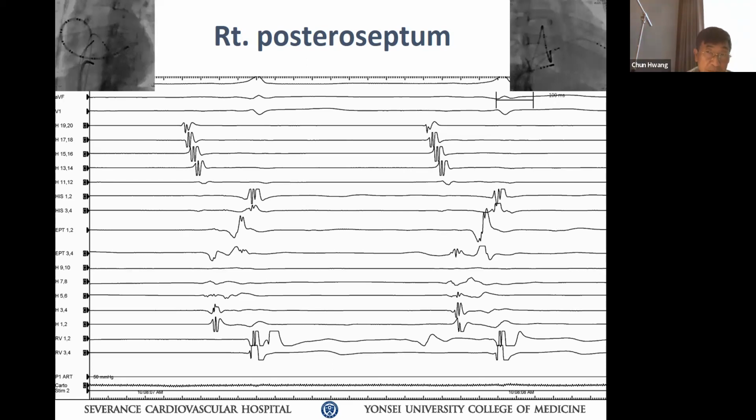It's very important. 그래서 꼭 캐테터 하나만 가지고 생각하지 말고 항상 you think about what other thing I can do in this case to improve my ablation. 그러니까 일단 잘 봐야 어블레이션 할 수 있는 거기 때문에 제가 보기에는 첫 번째 케이스는 아쉽게도 매핑을 조금 더 촘촘한 캐테터 했으면 좋지 않을까 그렇게 생각해요. Okay? Alright. Go ahead. Sorry, I interrupt you too much.